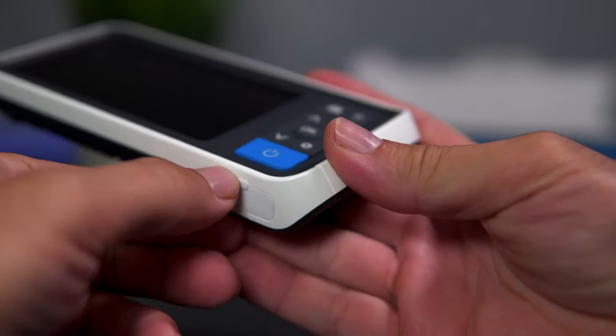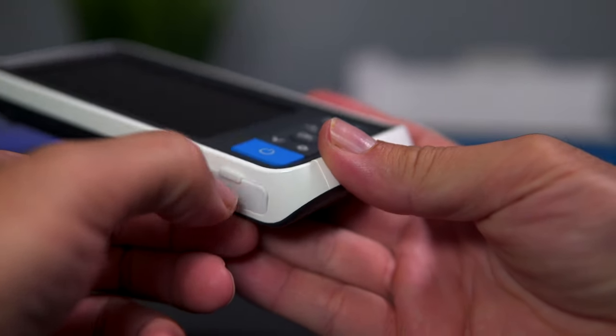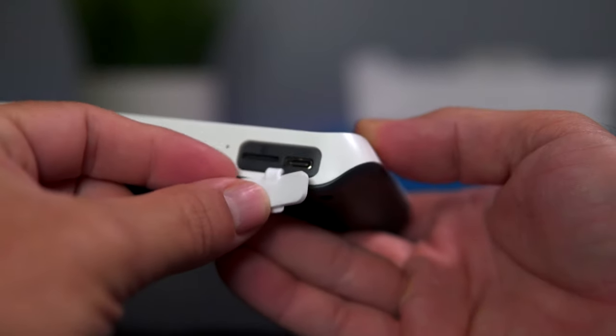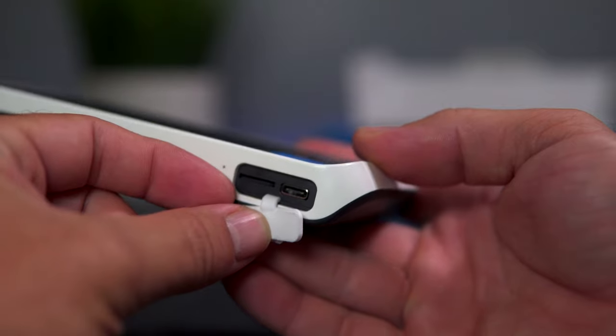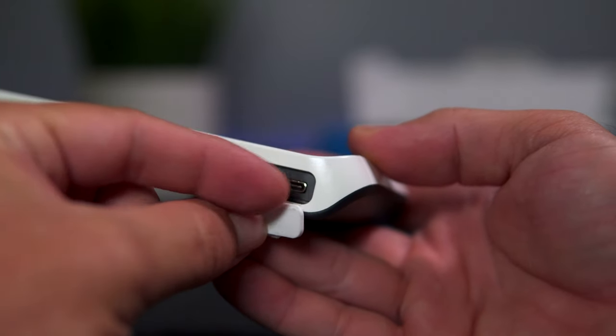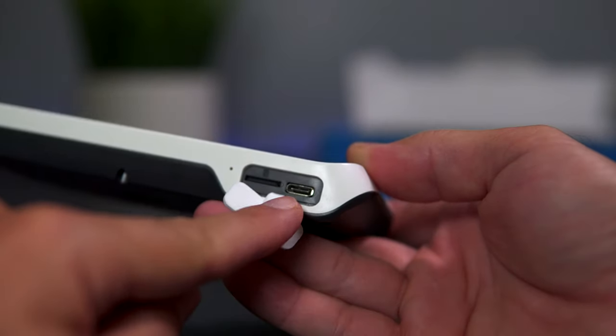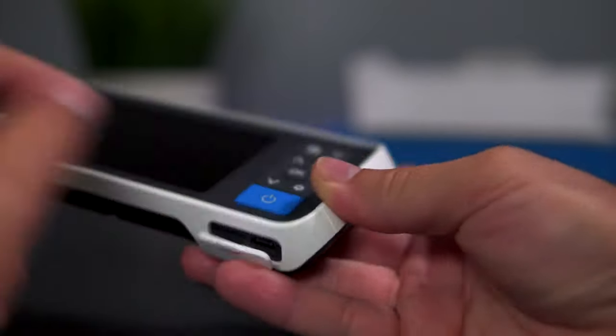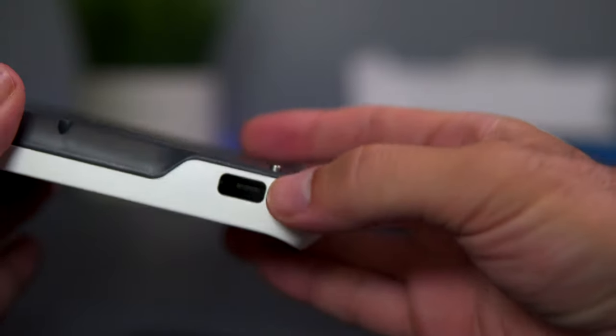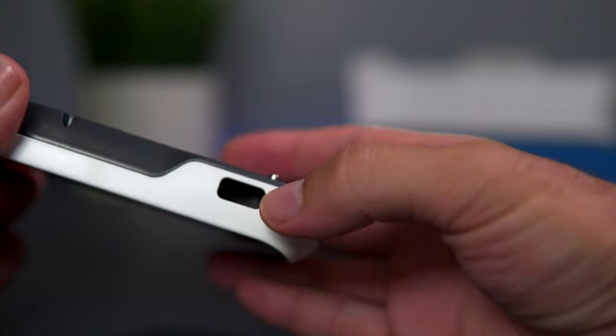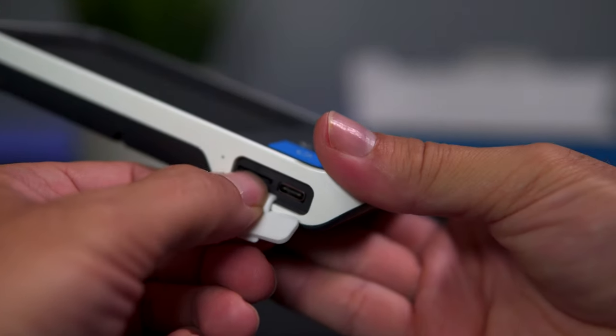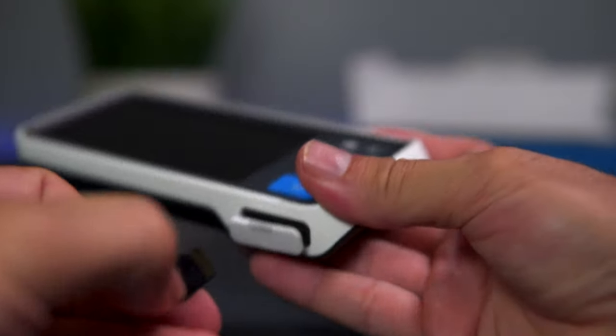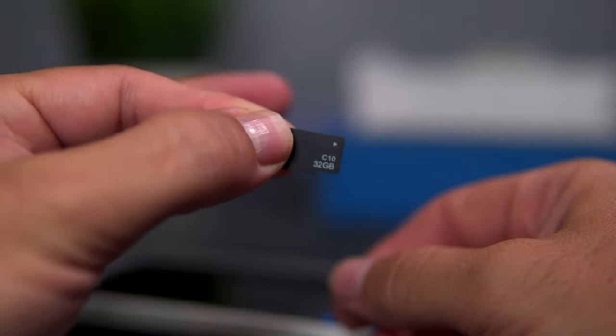On the bottom here, there's a little door that pops open. We have a micro SD card in there and another USB-C port. This one's probably for charging, and this one is for the camera communication. Let me pull out the SD card and see the size. It looks like a 32 gig card is included.